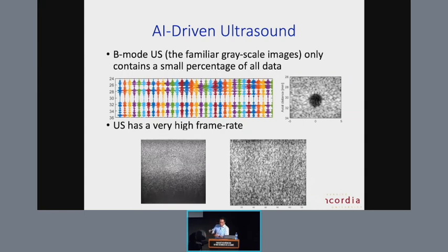So you can see the motions are large. And in the right, you have to pay very close attention to see the motion because here we are using acoustic radiation force in the lab. So ultrasound can be focused. And when ultrasound is focused, it has the power to actually move the tissue. So here we are moving the phantom with acoustic radiation force. And again, from the pattern of this motion, we can infer biomechanical properties of the tissue.